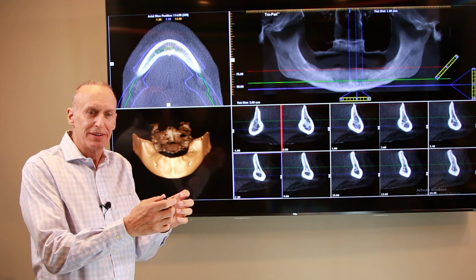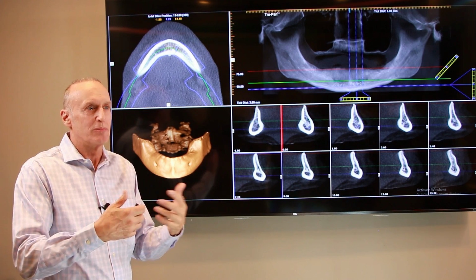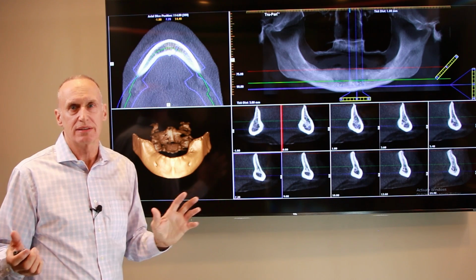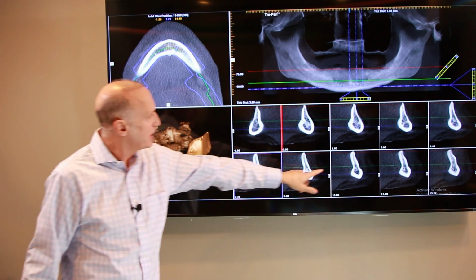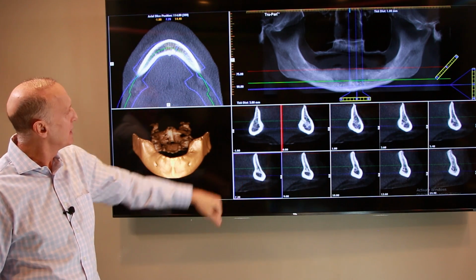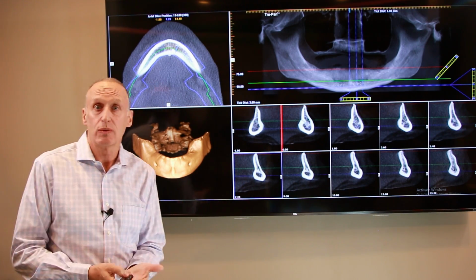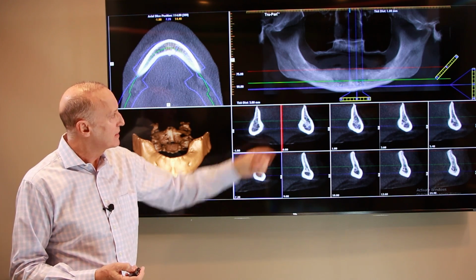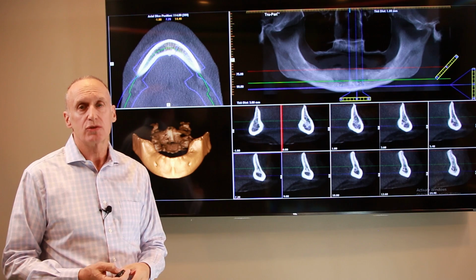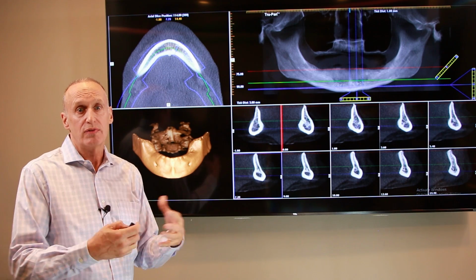It's custom treatment planning and custom treatment, where your treatment is based on your diagnosis, your bone volume. There's so many things to consider. We're going to get into that in just a minute too. But when we look at, this is a patient with very bad bone, okay? And again, sometimes we can't do implants on everybody. It's super rare, but patients with bone like this, we struggle in coming up with a treatment plan to fix them.